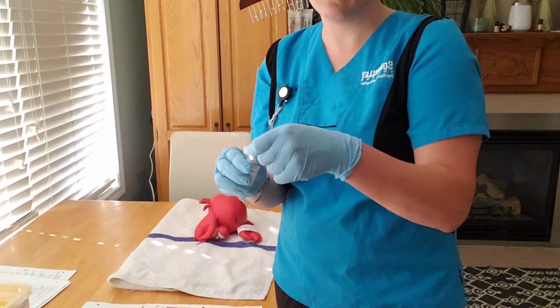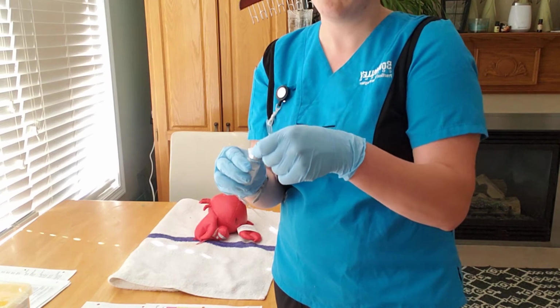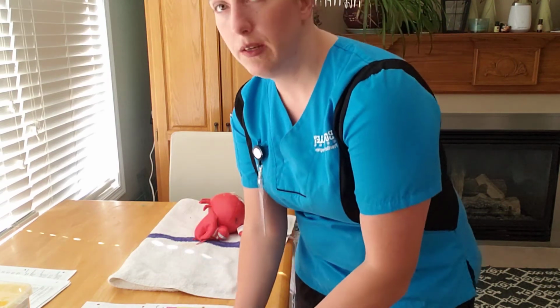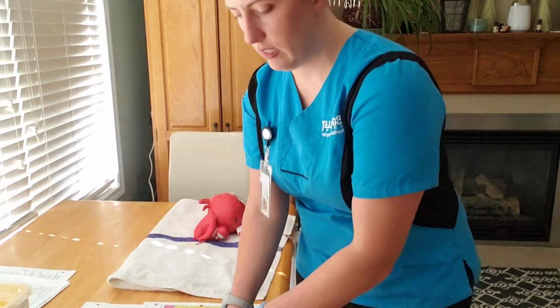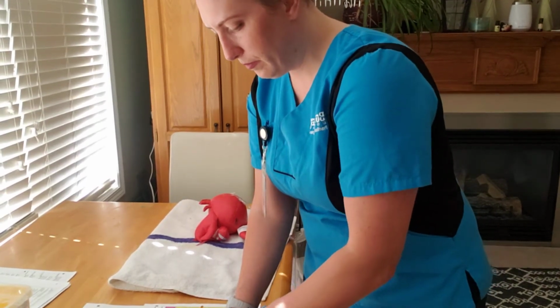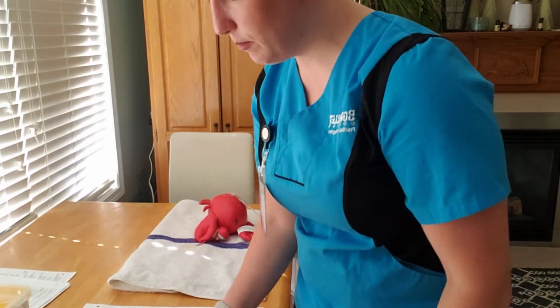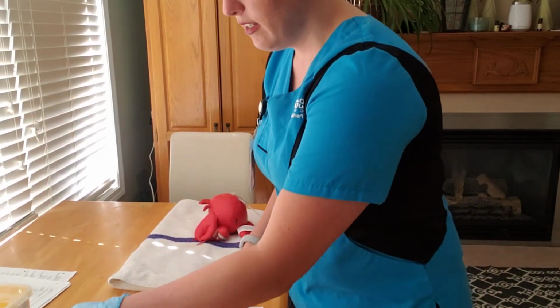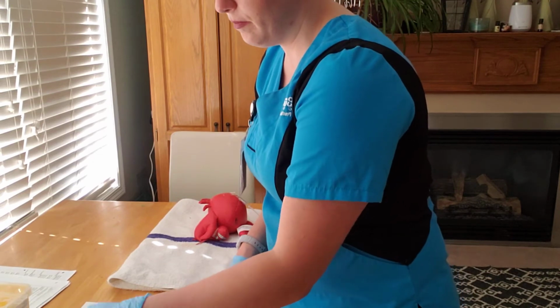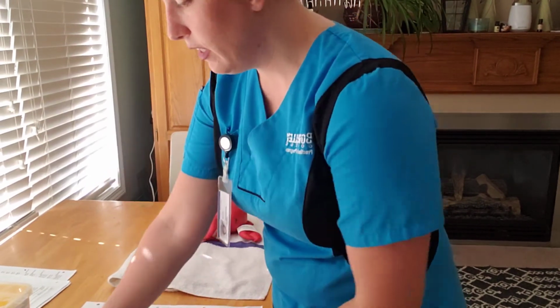Okay, that's 30 seconds and I'm just gonna let that dry. Okay, it looks dry now.